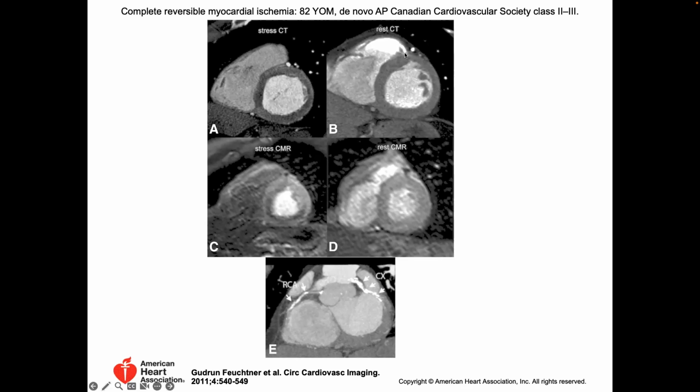And so at rest, you see a signal intensity that looks like this. And at stress, you can slightly perceive there might be some dark spots here. Stress CT, it's not great. I have to tell you, theoretically it works. Practically, these signals, as we saw the other day in the physics talks, are kind of on the order of the natural artifacts in cardiac imaging and CT. And so these differences are really small, unfortunately. It'd be great if they were big, because look at the resolution, right?